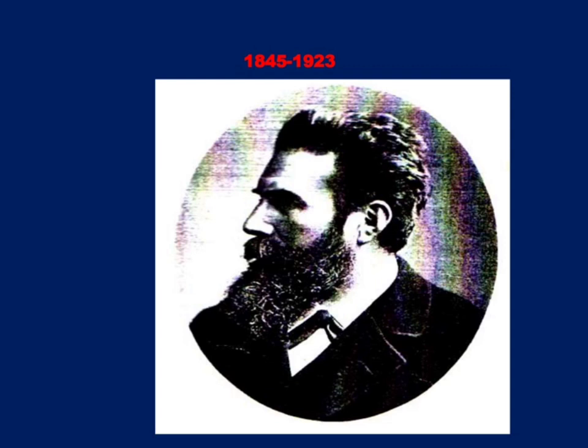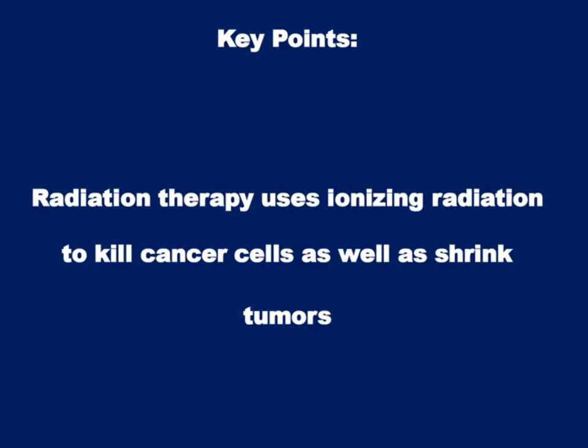by remembering Sir William Conrad Roentgen, who was the father of radiotherapy and the father of radiology as well. He discovered the X-ray in 1895, and onwards the journey of radio diagnosis and radiotherapy begins. Radiation oncology involves radiation therapy by use of ionizing radiation to kill the cancer cells as well as shrink the tumors as much as we can.